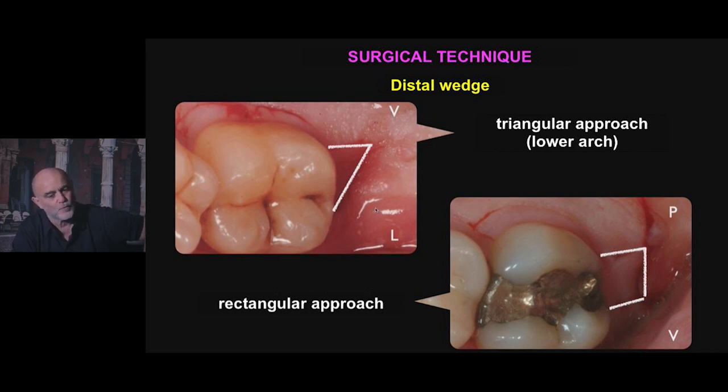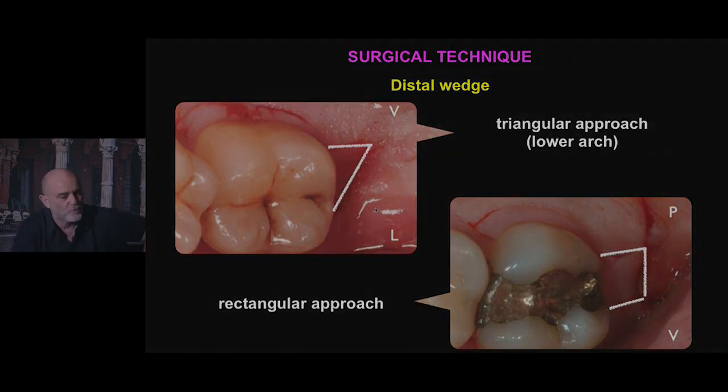At lingual level, instead of making a parallel incision — which would be the same as what you do in the upper arch — you go straight to converge to the most distal point of the vestibular incision.